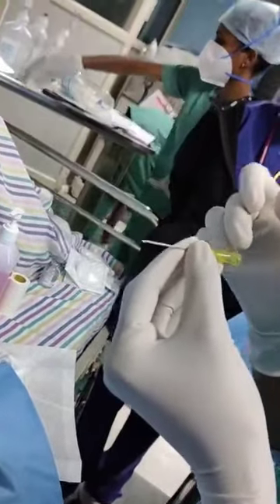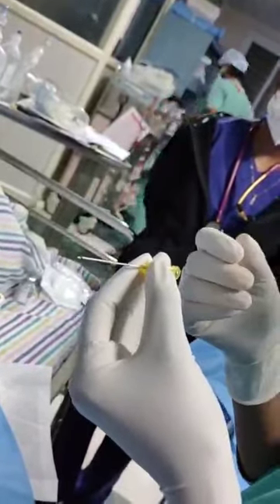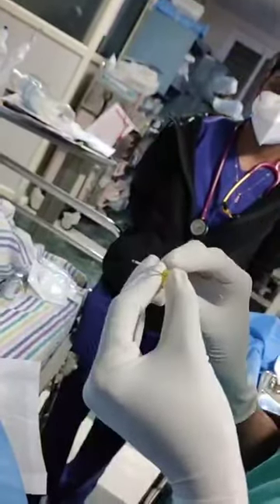the flow will come. Arterial flow will be pulsatile, and venous will be slow. So you can differentiate.